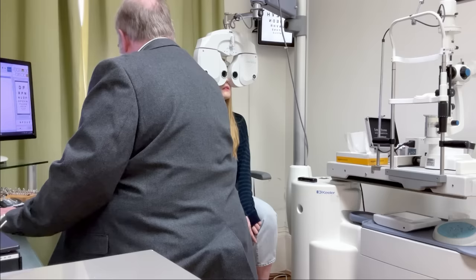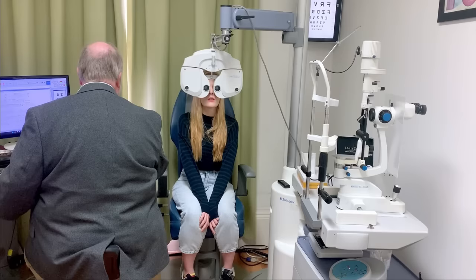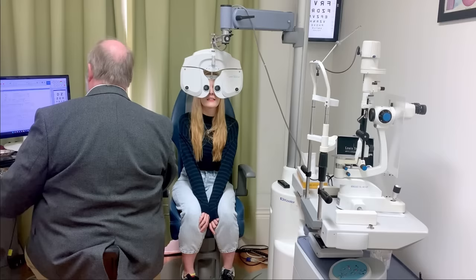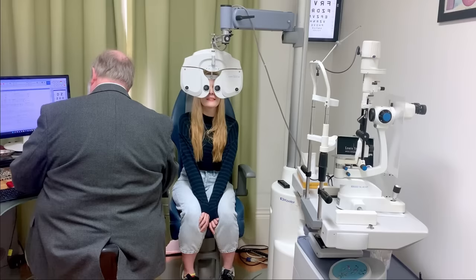And again, let me give you some new letters. Can you see the bottom line again? H-N-F-U-R. And is it any clearer with this one? Oh, yeah, it is. A little bit easier there. Any better with that one? The one before was better. That one's better. Lovely. Come back to this one. Unfold that one. That feel a bit better now? Yeah, it's great. It's so clear. Looking quite well down the bottom there. And if I give you that one back again, does that look quite easy? No, not easy, but I can try. Have a go. Oh gosh, it's a P Z U.